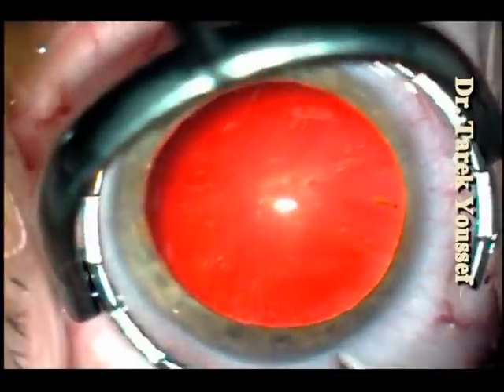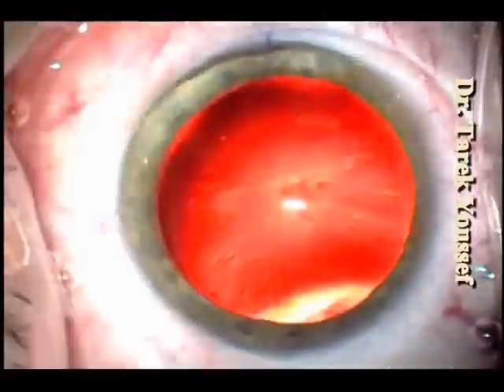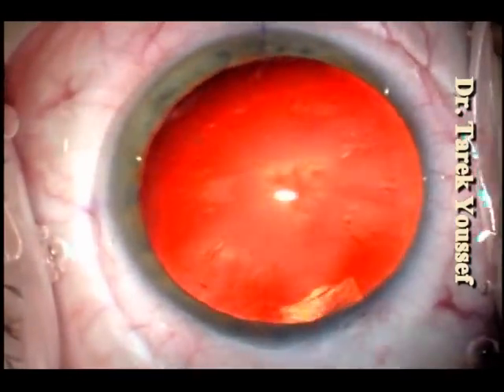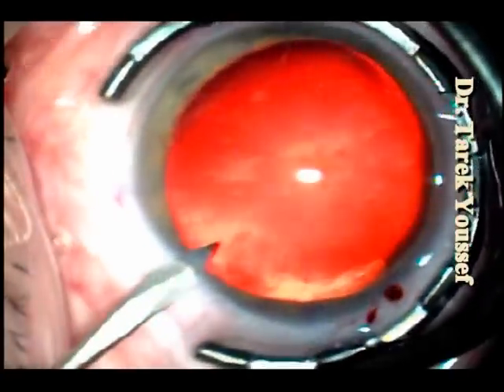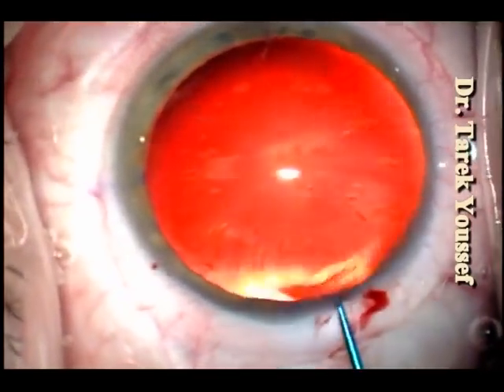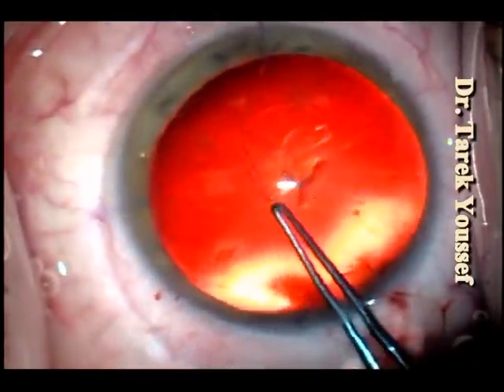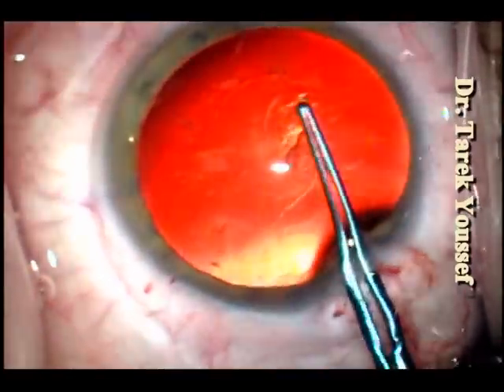Hi, this is Dr. Tarek Youssef speaking. I'm presenting to you today a case where the patient has a cortical posterior subcapsular cataract with high corneal astigmatism of four diopters. We're going to do a phacoemulsification and the lens is the Alcon SN60T5 to correct as much as possible from the astigmatism. She had monovision with the other eye for close vision.